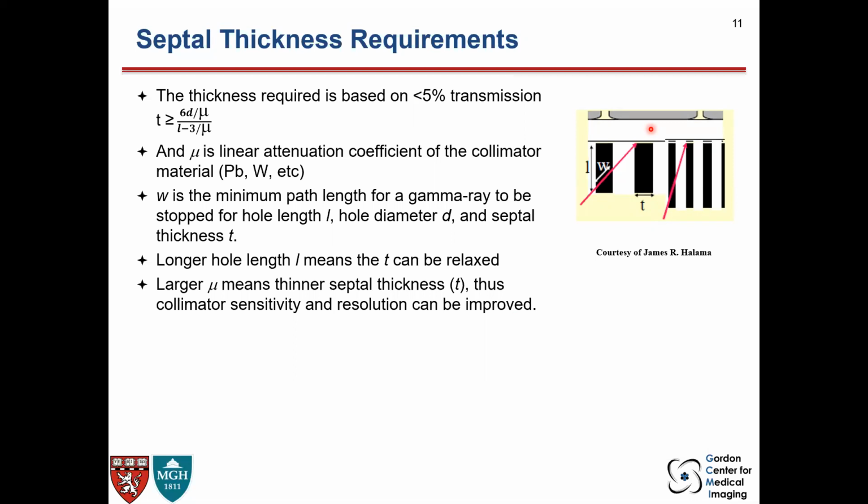That is the most important factor to take into account here. And again, if you can relax on the length of the collimator wall, that means a longer collimator wall, that means T can be smaller, and meaning lower cost, typically lower cost.